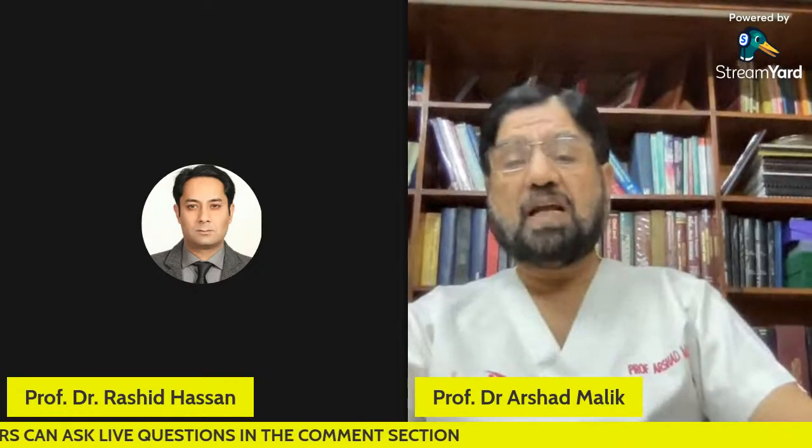Next is the hard tissue. We have the water laser, the erbium laser, that we use to cut the enamel and dentine for caries. Rather than going for GV Black's classification, extension for prevention, class 1, class 2, class 3, class 5, there is no need. Just go for ablation of the hard tissue, which is the carious part, remove it, evaporate it, and you have a rough surface. You don't even need etching of the area for the composite filling. You just place the filling material, light cure it, and it is retained like anything without losing good enamel or dentine tissue. We are going to have a very good filling. Then is the perio.